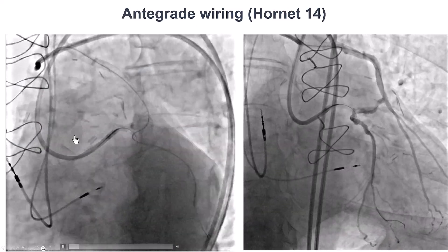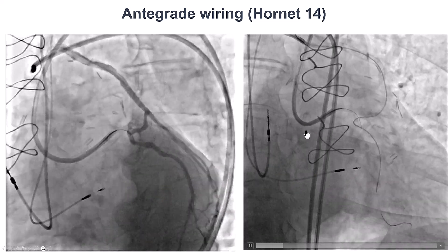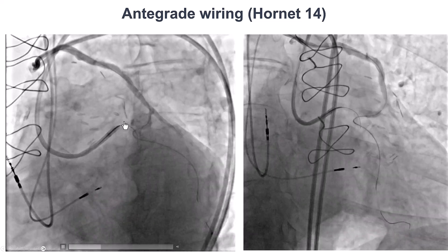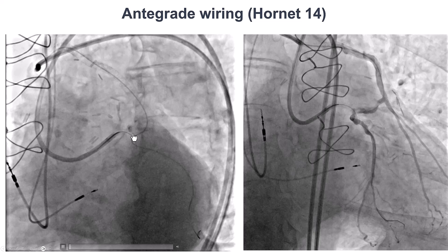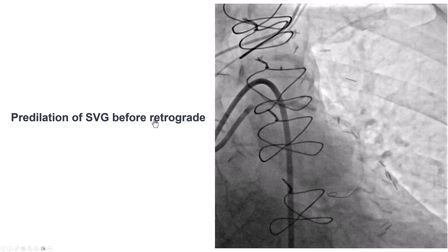We tried to wire using various guide wires, including a Hornet 14, but the guide wire went into the extraplaque space. Because of the bifurcation, extraplaque re-entry is not a good idea here. Therefore, this was time to convert to retrograde.